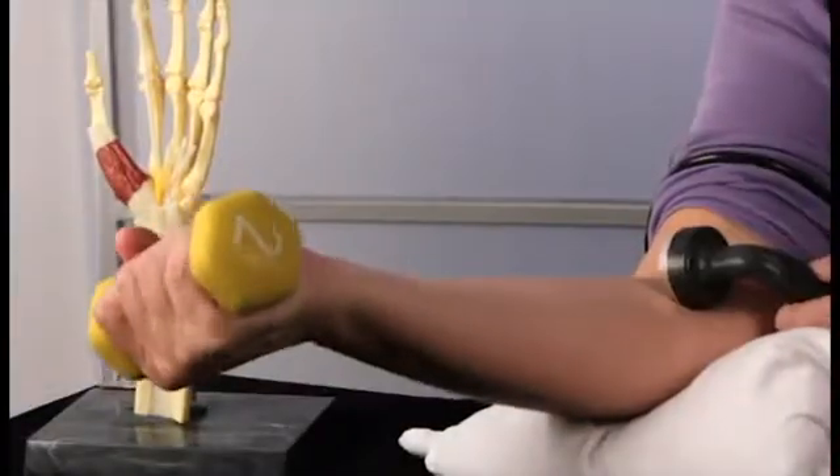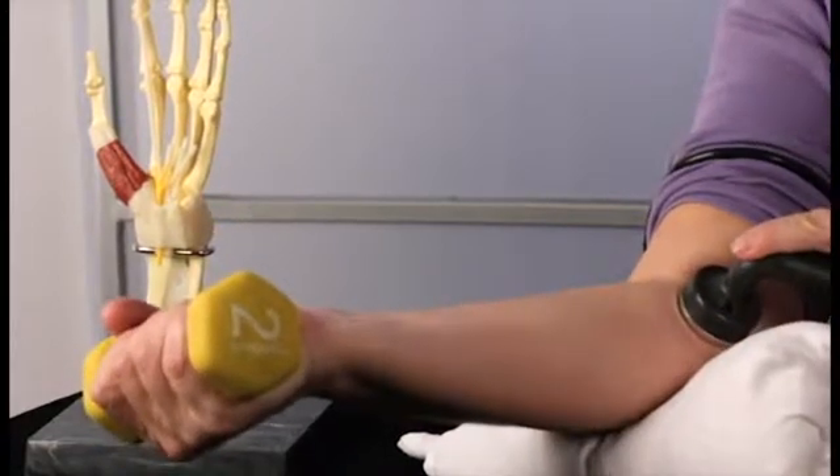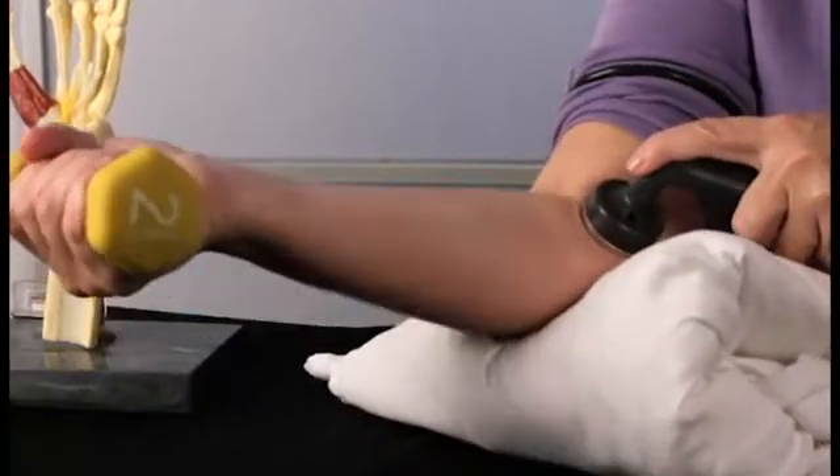The literature recommends that we use continuous ultrasound to increase tissue temperature. You can use 3 megahertz at 0.5 to 1.5 watts per centimeter squared, or 1 megahertz at 1.5 to 2.5 watts per centimeter squared, for 5 to 10 minutes.